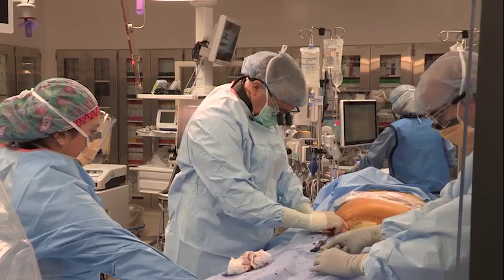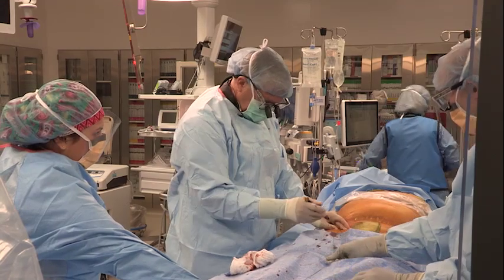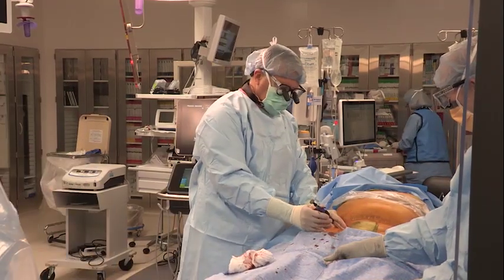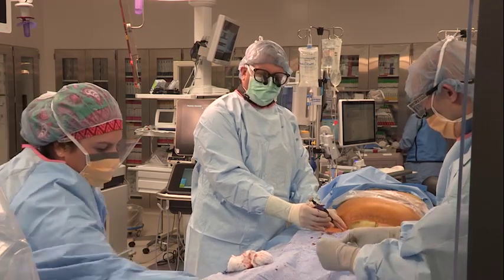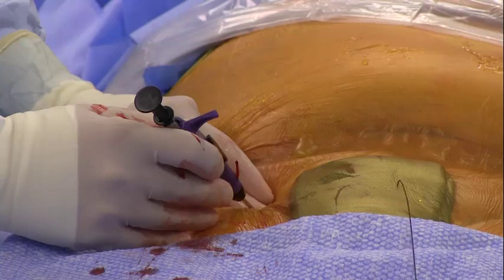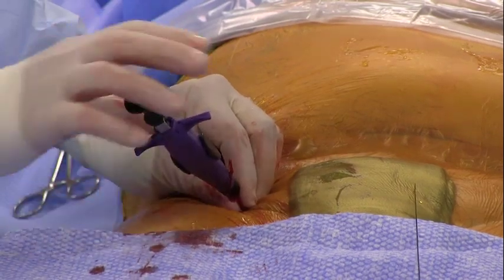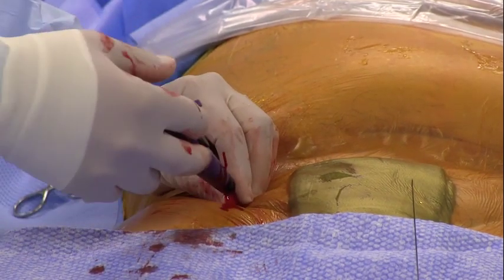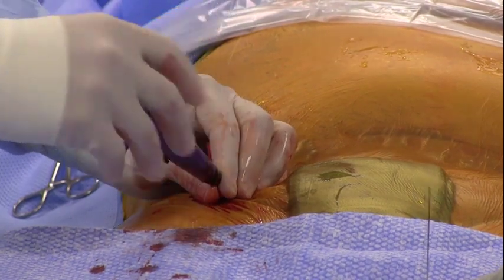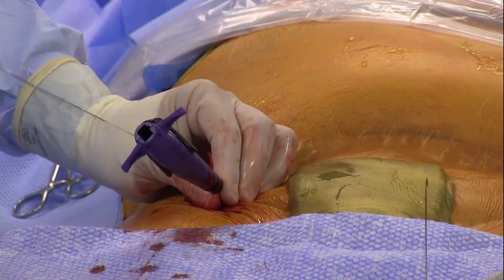After femoral artery access is obtained, the Perclose ProGlide devices should now be used to set up for access site closure at the end of the procedure. Exchange the 6 French sheath for the first ProGlide device and deploy the device with a 30-degree medial rotation.